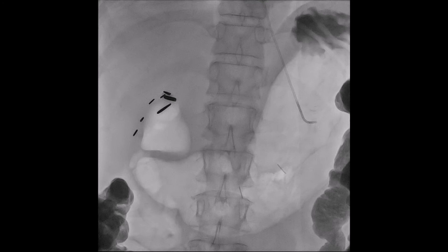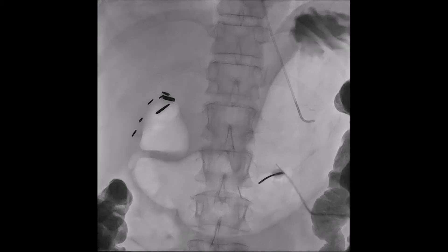This is a still shot in the AP projection with my 18-gauge needle in place, ready to advance for the gastrostomy tube. I'm splitting the difference between the two T-tacks for placement, and positioning the needle equidistant between the greater and lesser curvatures of the stomach. I also direct the needle slightly laterally — in the event I need to convert to a GJ tube later on, this slight lateral drift makes for an easier conversion. Not mission critical, just my personal preference.